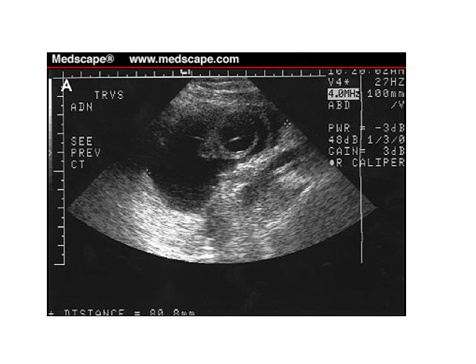Now assume that the date is up here. I think the patient name was up there at top, all right? So the information is on there for the person, all right? And keep this in mind because this is going to be really important for fun with ultrasounds. Here is the scale on this side, all right? So take a peek at the scale on this side as well.